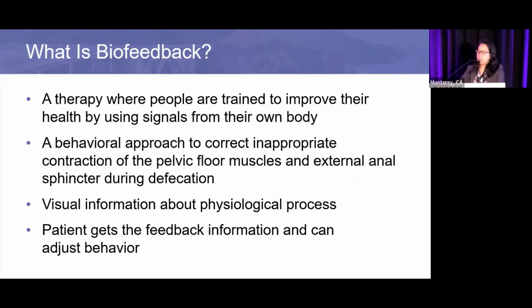All right, I'm gonna switch gear a little bit. So you diagnose them with, let's say, dyssynergic defecation or fecal incontinence. What do you do with them? You know the laxative probably is not gonna be effective. So the way to treat them is biofeedback. So what is biofeedback? Biofeedback is a therapy where people are trained to improve their health by using signals from their own body. It is a behavioral approach to correct inappropriate contraction of the pelvic floor muscle and external anal sphincter during defecation.